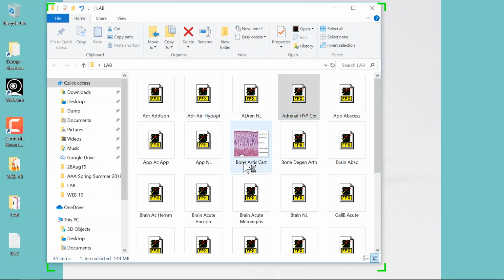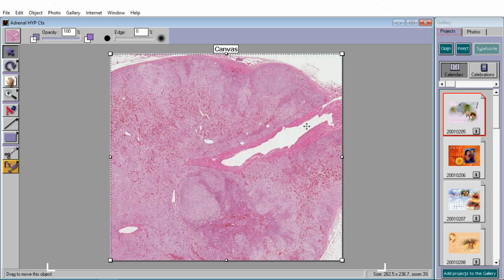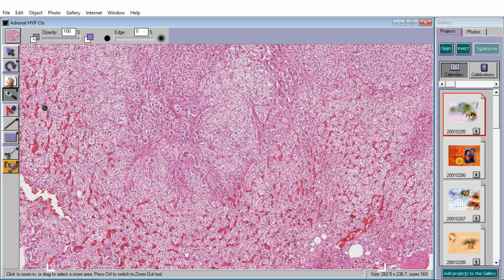It looks like we might have another adrenal gland. And look, it looks like maybe there are some big blood vessels there, but look how thick the cortex is now. So if we would have counted 100 cells or 1 millimeter, let's say, as the thickness of the previous cortex, this layer looks like it's very, very big. In fact, I'm going to zoom in on a lot of it. Look, it's still very vascular. You have all these blood vessels, but now the cells look like they're really thick, and they're not thick uniformly. They're kind of thick, almost perhaps in a nodular fashion.